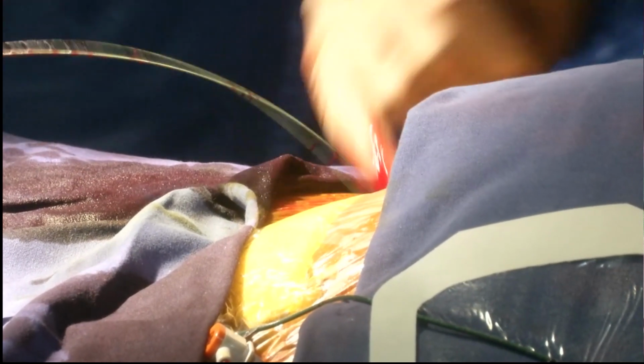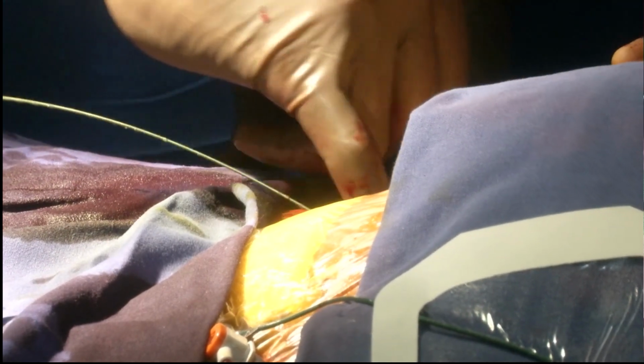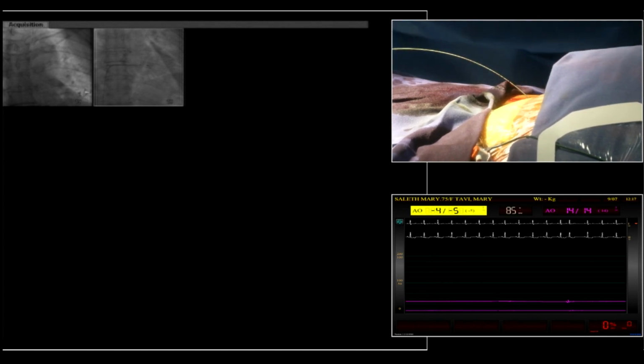Praveen just mentioned the bullseye. This is what we use in our lab as well. Should everybody be getting on to an ultrasound guided puncture, or are you quite okay with the bullseye type technique, where you get the catheter from the contralateral side, put the pigtail at the spot where you want, and then just hit it?